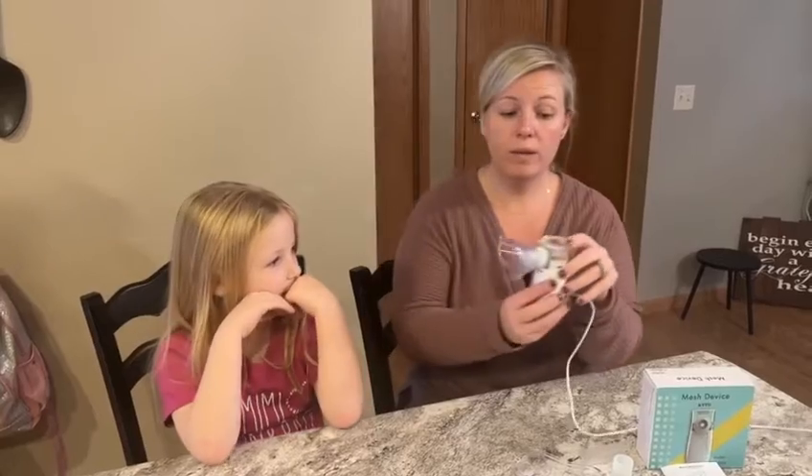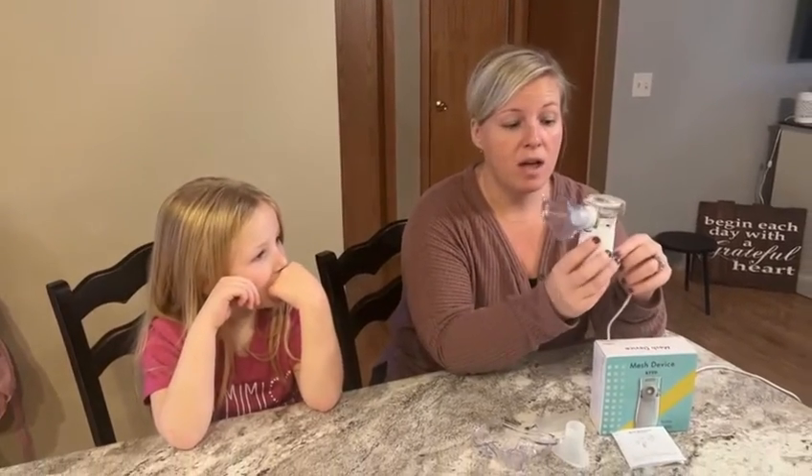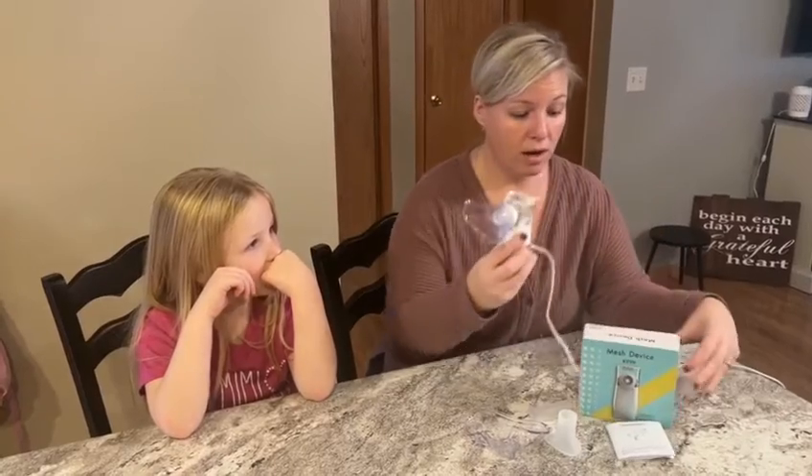So we really recommend this. It's one of those household essentials that you really should have. This is a great product — we really recommend that you get one from Amazon as well.